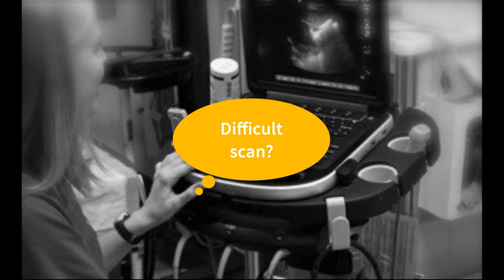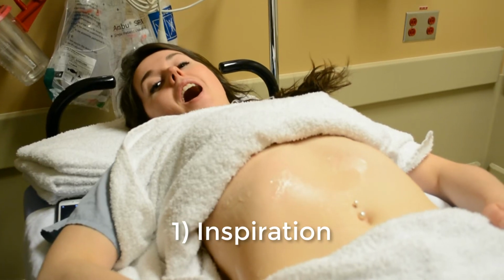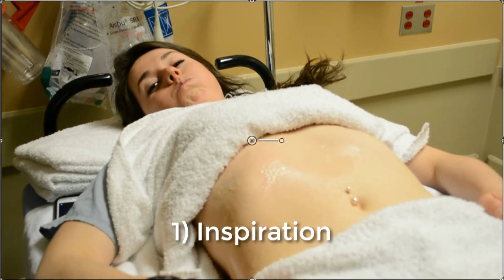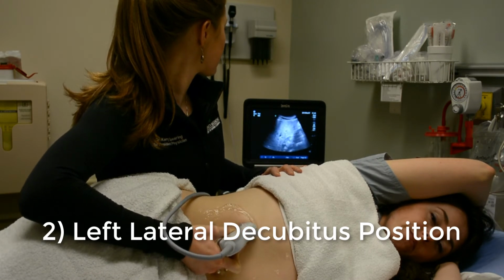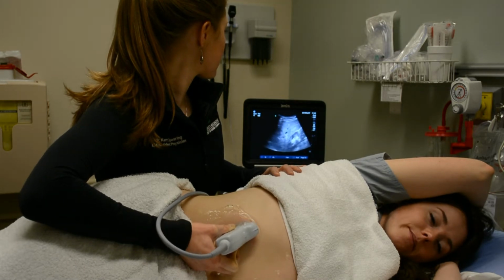If the gallbladder is not adequately visualized on your first sweep, try any of the following maneuvers. Number 1, repeat the slide after the patient has taken a deep breath and held it at maximum inspiration. This maneuver will move the liver caudally and may push the gallbladder out from behind the ribs and into view. Number 2, placing your patient in the left lateral decubitus position may also assist your scan by bringing the gallbladder out from under the ribs.